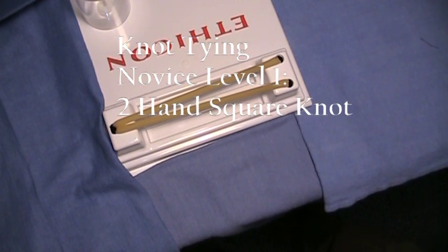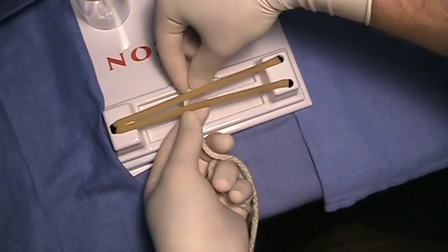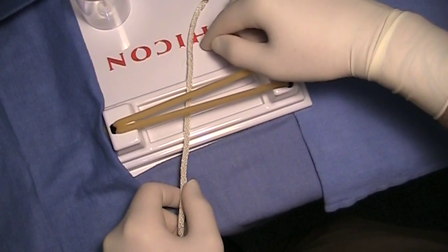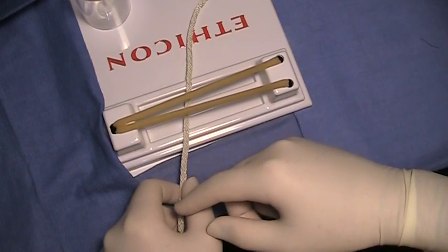The second component of the third year practical, and the standard technique required for all third years, is the two-handed square knot. We'll start for right-handers. The short end of your rope will be above the wound and will be in your right hand. The long end of the rope will be below the wound and in your left hand.